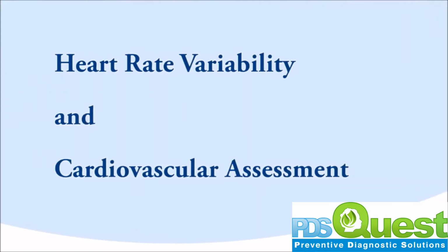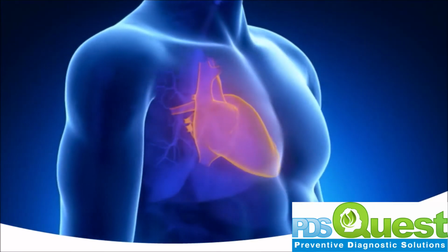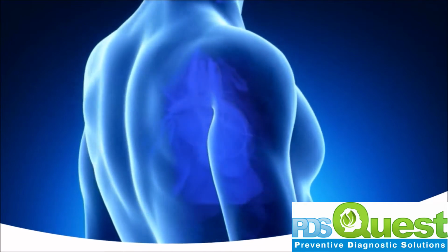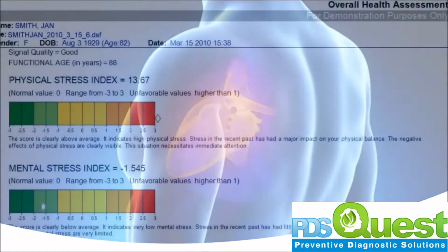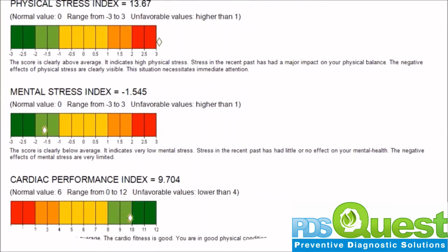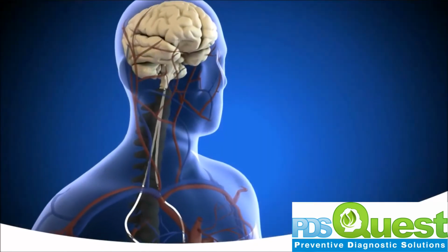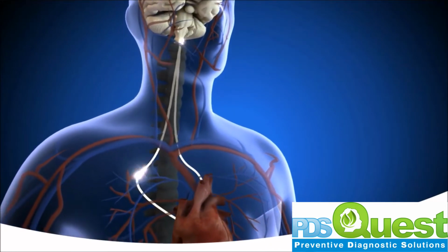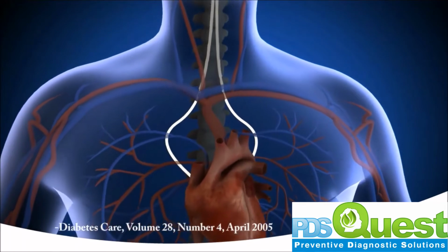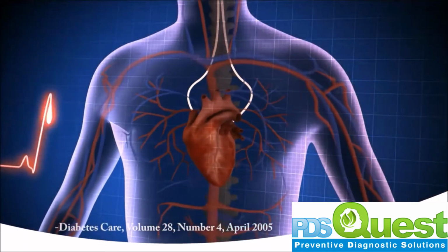A cardiovascular fitness test is a cumulative fitness assessment that measures training or fitness level, cardiac and vascular coefficients, and the response of the heart vascular reaction during orthostatic stress, such as moving from a seated to standing position. These tests and assessments affect heart rate variability, monitoring the body's response to stimuli, such as medications and treatments. According to the American Diabetes Association, a patient's history and physical examination are ineffective for early detection of CAN. Therefore, non-invasive tests that have demonstrated efficacy are required.